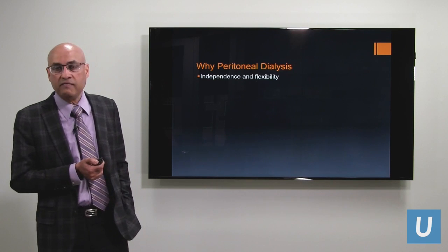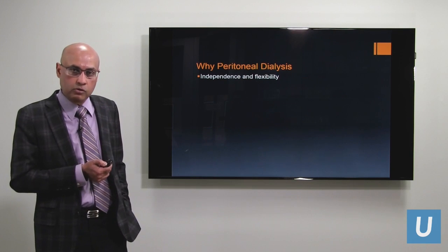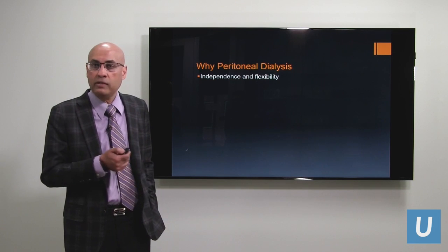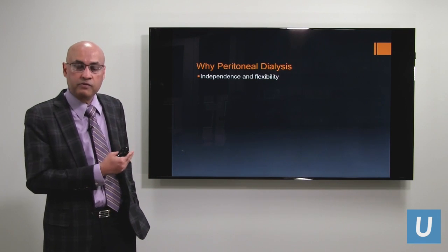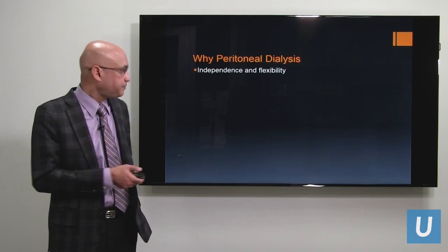One is independence and flexibility. So once you're properly trained, you can do dialysis at home. If you want to do dialysis at 8 p.m., you can do it at 8 p.m. If you want to do it at 9 p.m., you can do it at 9 p.m. It's not like in-center hemodialysis, where you have a shift that you have to go for. It gives you a lot of flexibility and a lot of independence. If you have something to do that night, you can do it a bit later that night.